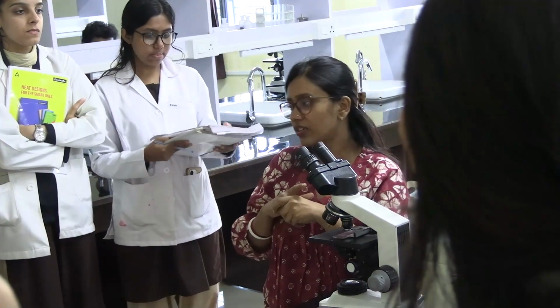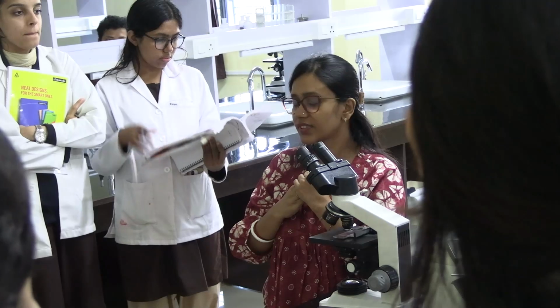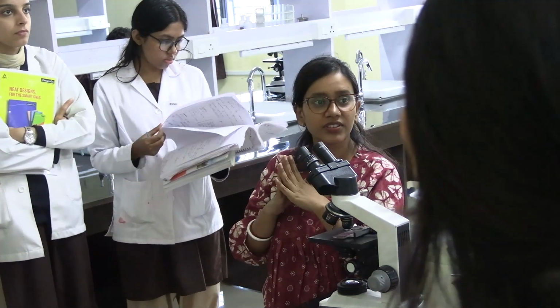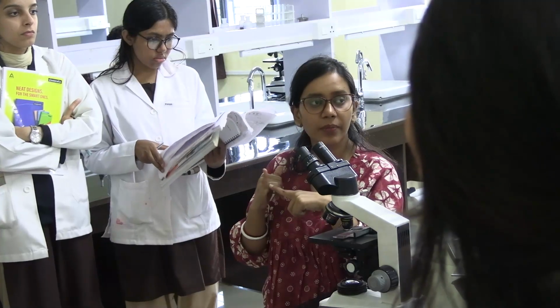Cytoplasm. Wrong. In a cell, if I have to call a cell malignant, what do I see? If some point is missing about the nucleus.